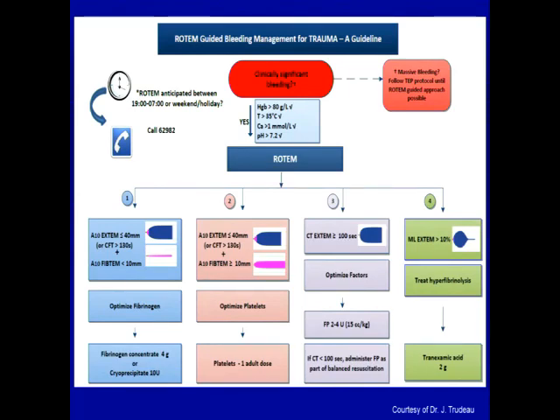So if you have a 90-minute resuscitation, you could theoretically, and it would make sense to, do it every 15, 20 minutes, given a round of products. Postpartum hemorrhage would be the other situation where it could change that quickly in the clinical scenario. In hearts, I've often seen big changes over 15, 20 minutes. Normal ROTEM, surgeon says we have a lot of bleeding, do it again, it's abnormal.